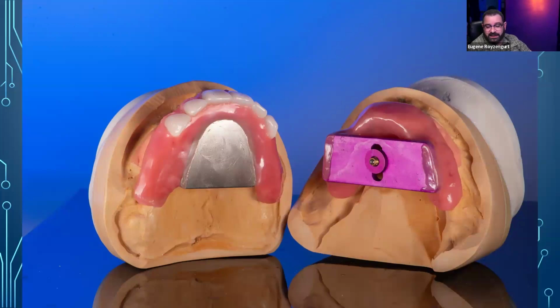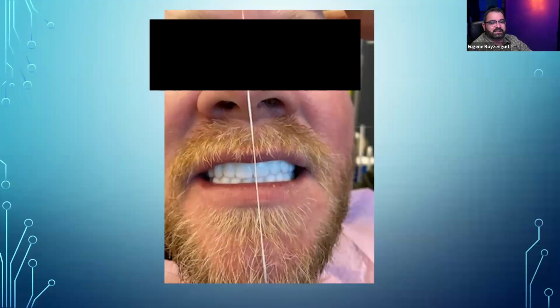The only downside for doing digital try-ins, guys, is that let's say, for example, I want to rotate this canine chairside, or I want to move some teeth chairside, you can't do that. You have to reprint the whole thing. So some doctors don't like doing that, and that's absolutely fine.